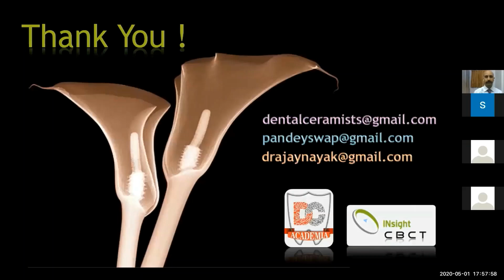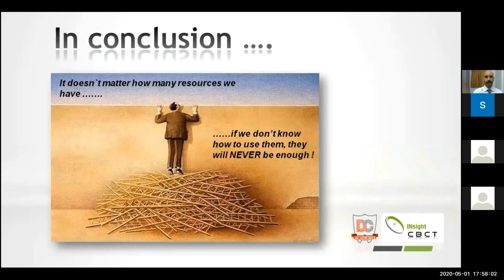Thank you very much, Swapnil and Dr. Ajay. I think you very wonderfully explained everything step by step for this particular kind of dentate case, where it's not a complete edentulous, but a partial edentulous case, where there were some colleagues who were asking about how do you mark those points.